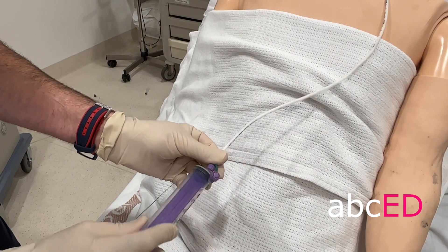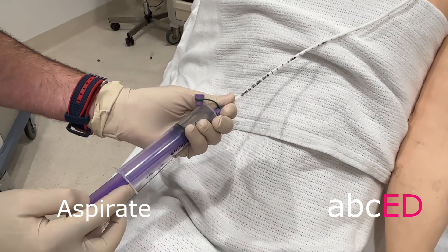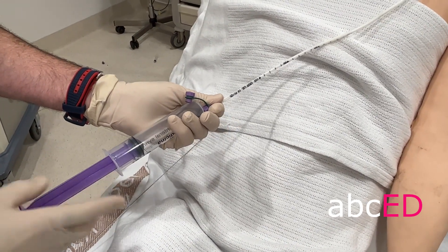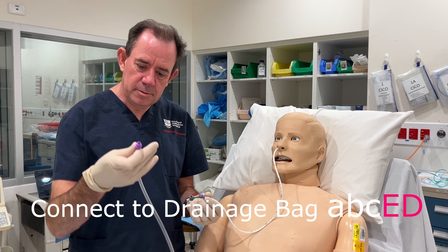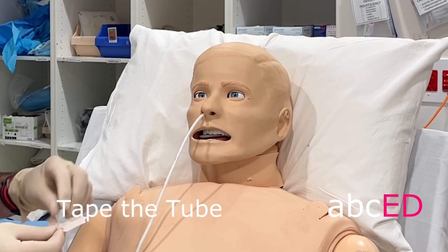Connect the special syringe and aspirate — you should get stomach contents coming into the syringe. With this nasogastric tube it just goes on to free drainage with a screw-on technique. Then tape in the tube.